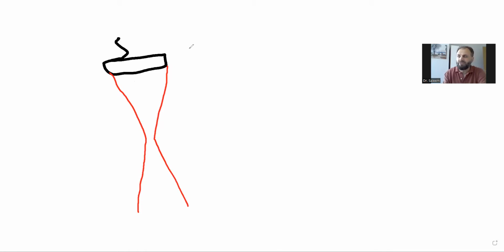Now, pretend there are structures, for example, one structure here, one structure here, and another structure here. Now three of these structures are parallel to the main axis beam. It means the sound pulses are going down from here, correct? All the pulses are going down, and these are the structures. The structures are front and back to each other, but they are on the same lane, parallel to the main axis beam. So the relationship of the sound beam with the structures is parallel, but the structures are front and back to each other.